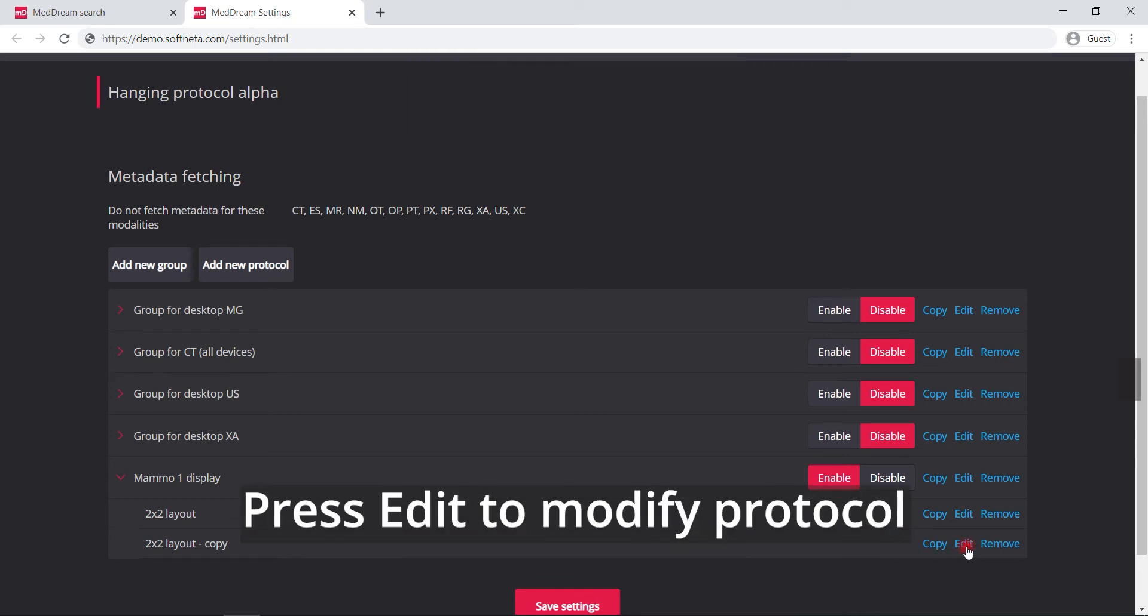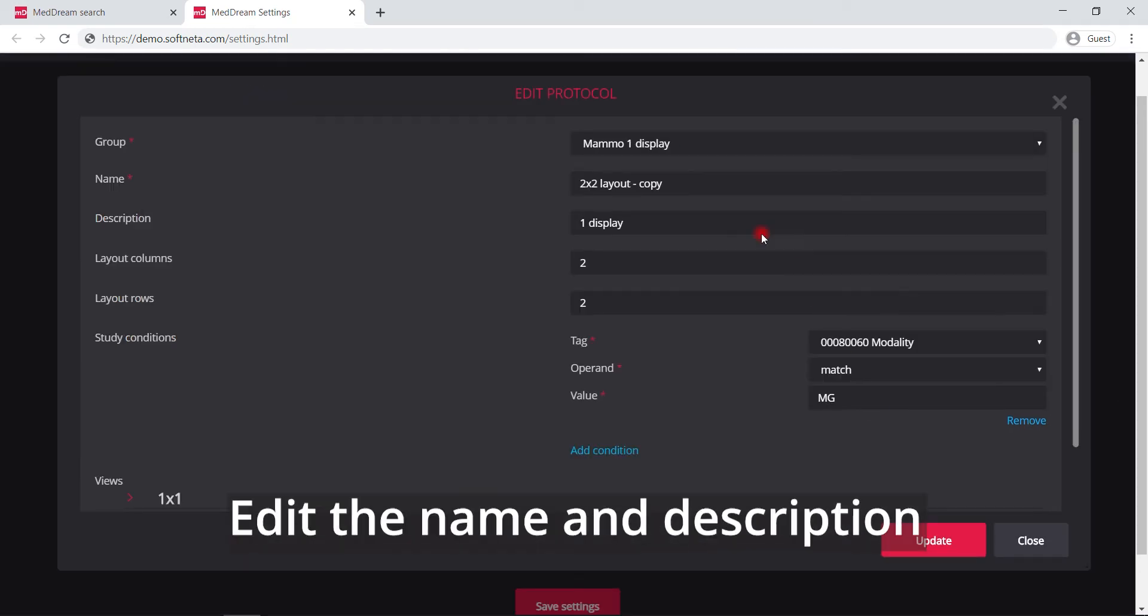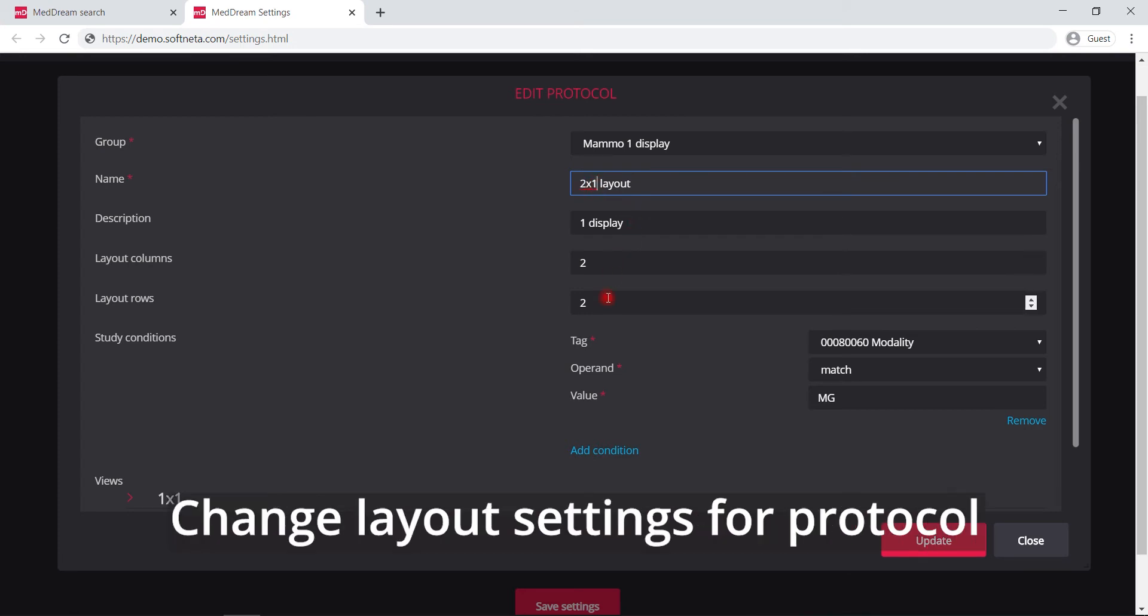Click edit to modify protocol. Edit the name and description if needed. Also modify the layout settings.